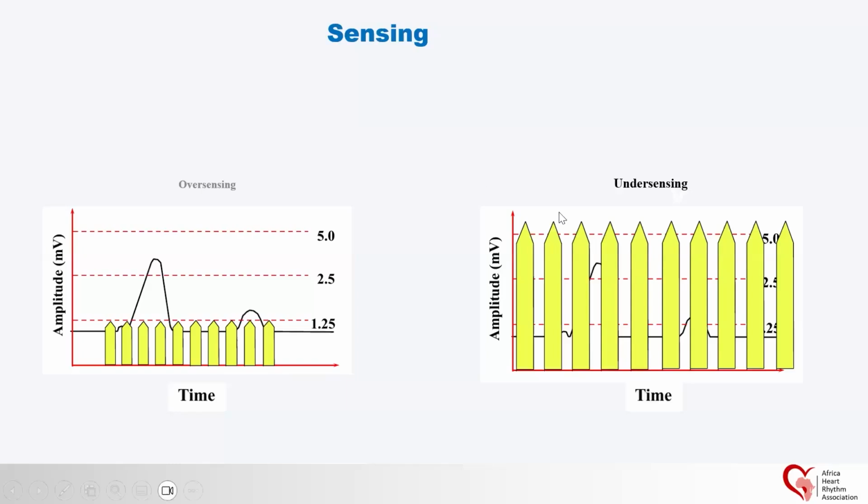Undersensing is when the pacemaker cannot detect, it is not sensitive enough to detect the intrinsic activity of the myocardium.